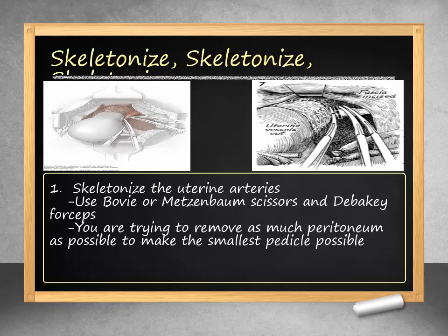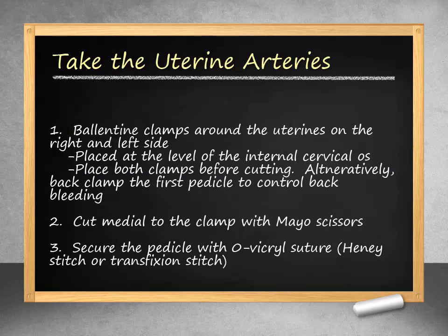Now we are almost ready to address the main blood supply to the uterus — the uterine arteries. In order to maximize hemostasis, we must first skeletonize the uterine arteries by removing any excess peritoneum. This is accomplished with DeBakey forceps and bovie cautery or Metzenbaum scissors. Once skeletonized, you may clamp the uterine artery at the level of the internal cervical os. Place clamps on both the right and left uterine artery before cutting. If this is not possible, you may choose to place a straight back clamp to minimize bleeding. Mayo scissors can be used to cut the pedicle. The pedicle is then suture ligated with Vicryl suture in a Heaney fashion or with placement of the suture at the tip and tied behind the clamp.